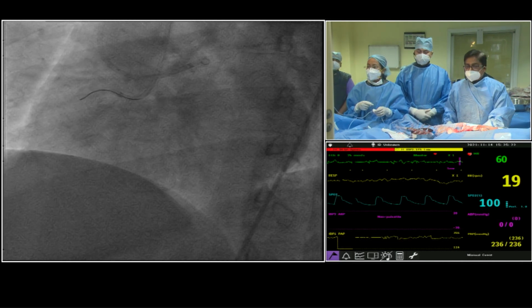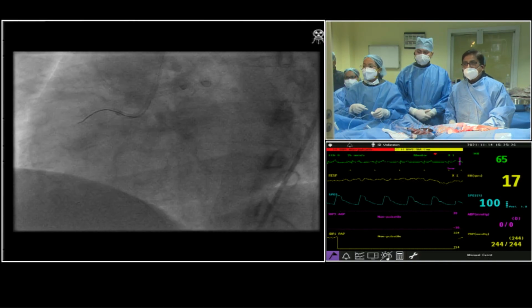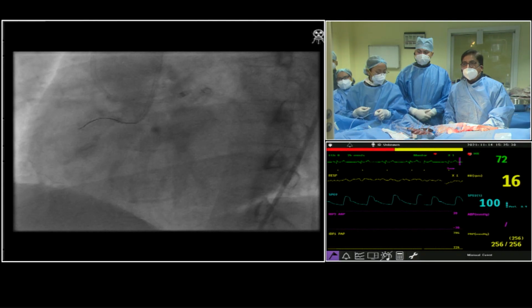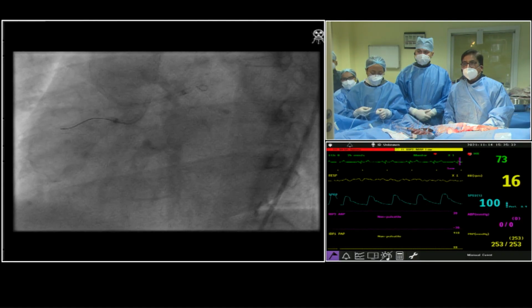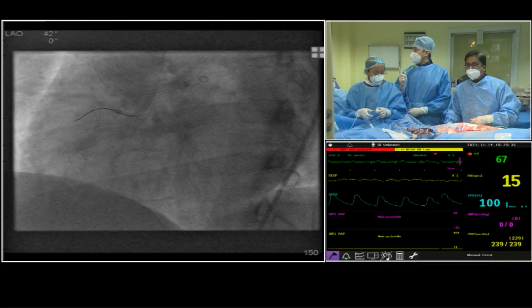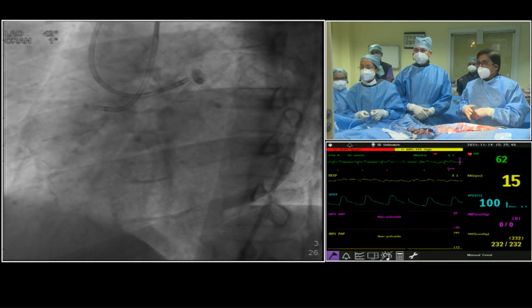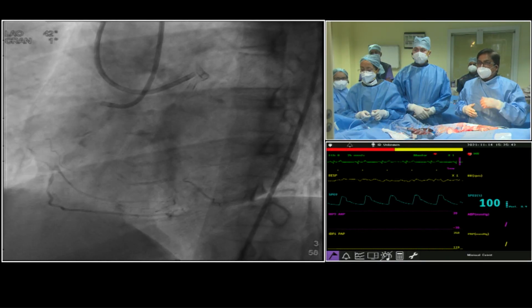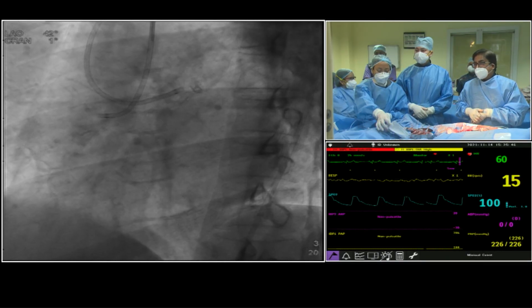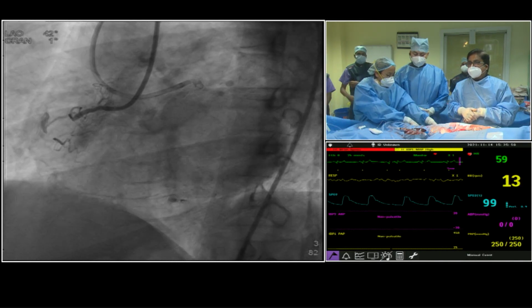Right now I just have a Sion wire to get my microcatheter in place. Dr. Goel sir, can you show the angiogram from the first angiogram today, the total angiogram, because we did not see the angio today. Show the angio. If you can show the old angio that we had seen sitting outside, that RCA angio, which will tell us how the RCA looked when the angio was done, but now it's looking totally different.